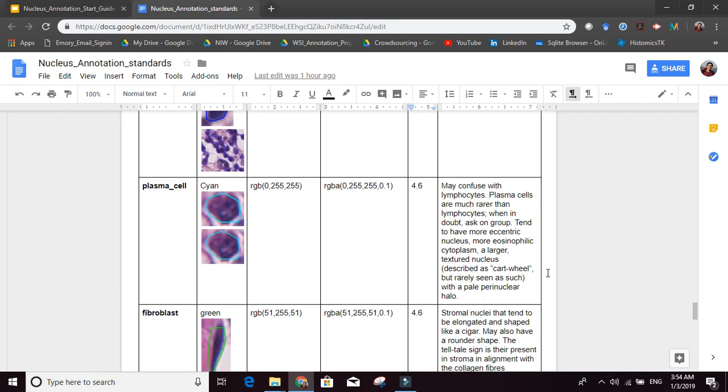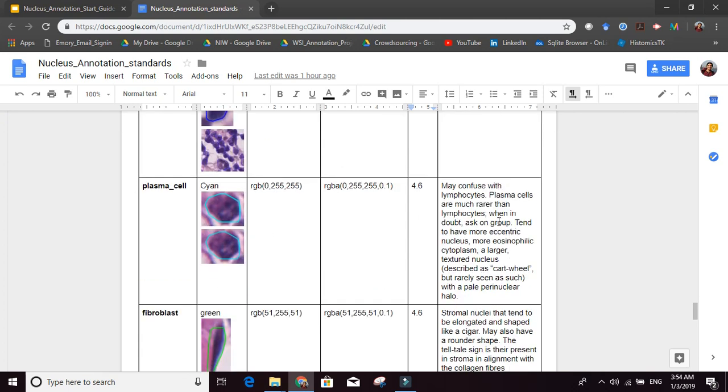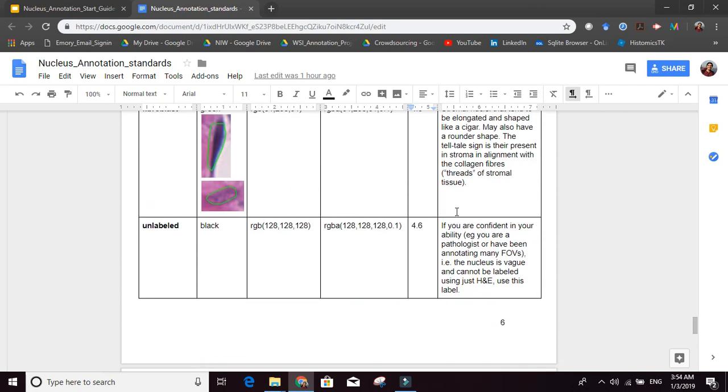Plasma cells are actually quite rare, so most of the time, if you're in doubt, it's probably a lymphocyte, all right? A plasma cell is rare, but if you see it, label it, okay? Fibroblasts, and if you're not sure or the nucleus itself is not possible to be labeled, just using H&E, then give it an unlabeled label, okay, if you will.